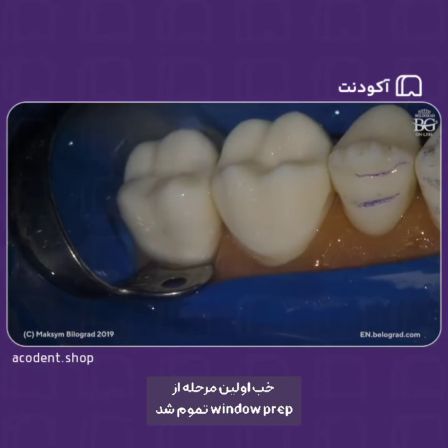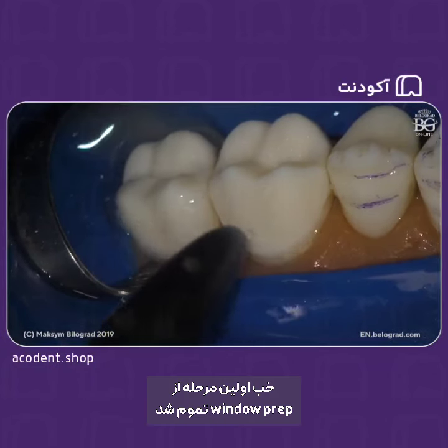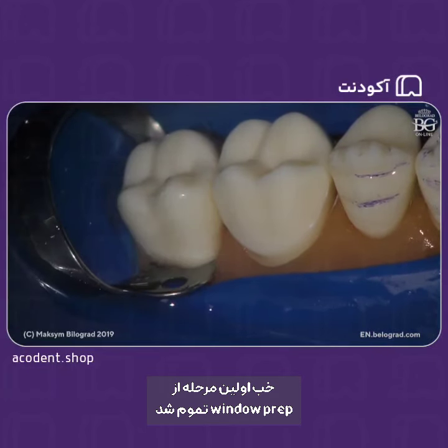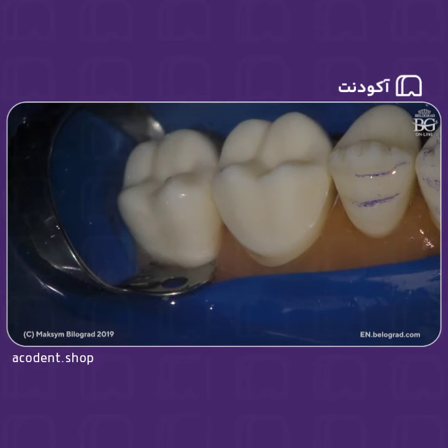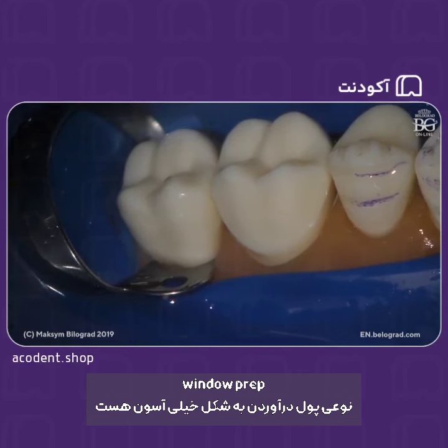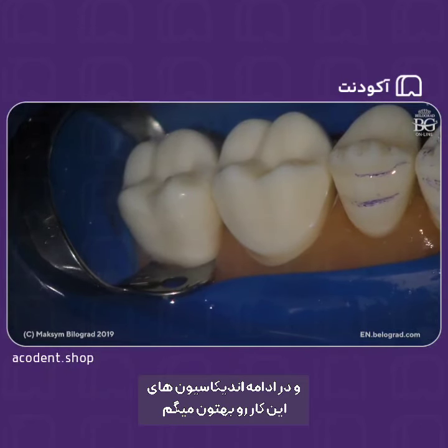So the first stage of window prep is done. Okay, it's done. Pretty nice. In some professional communities, we used to say window prep is easy money cases, my friends. I will explain the indications a little bit later on.